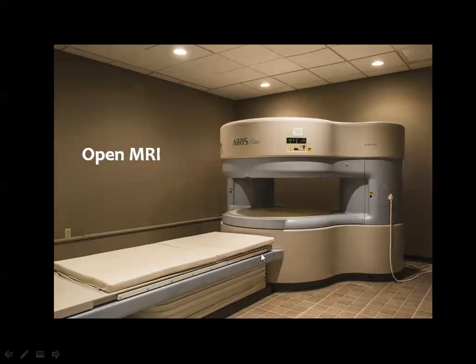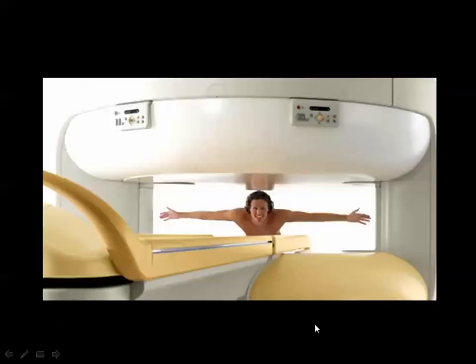In the open MRI you got a lot of space around the patient, and there is no more claustrophobia, and this is usually presented to assure the patient that there is no fear of a tight magnet and the space is too large around the patient.